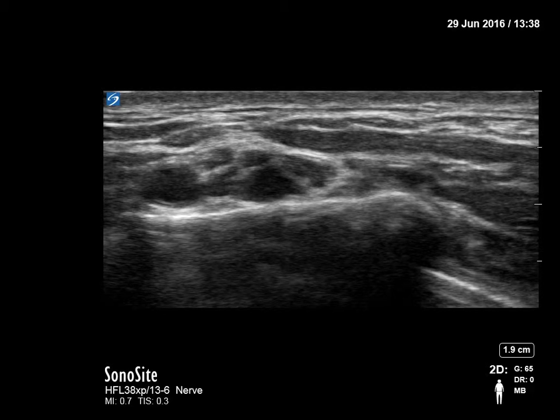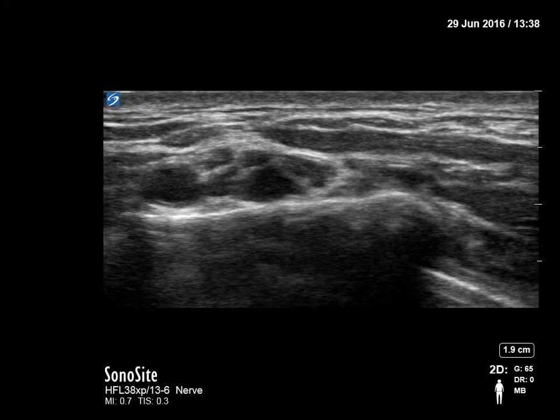On the left side of the screen, the round structure in the middle part is the subclavian artery, and just lateral to it is the supraclavicular brachial plexus — described as a 'bunch of grapes' in most books. The bright line below the artery and below the brachial plexus is the first rib. The plexus basically sits above the first rib and superolateral to the subclavian artery.